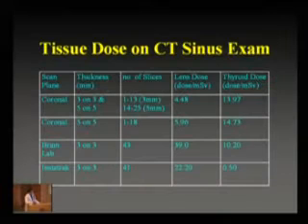But as I said, it is a trade-off, because the more cuts you do for your patients, the higher the dose of irradiation the patient will receive. Like in the traditional setting, with an average of about 18 to 25 cuts, the amount of radiation to the lens is between 5 rads to about 6 rads.